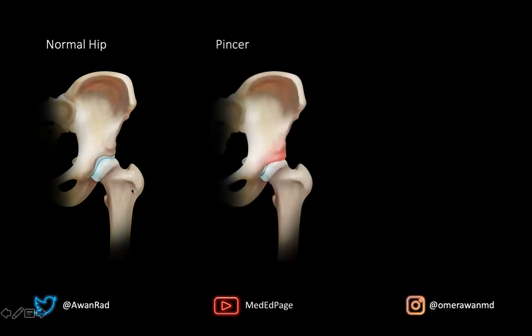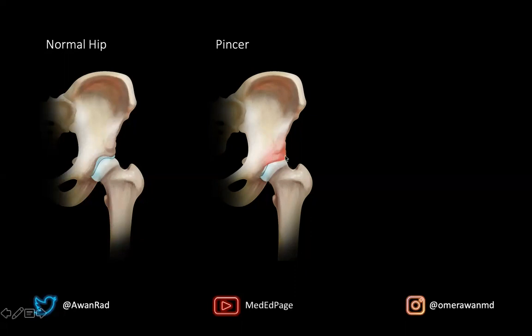In the pincer type of femoral acetabular impingement, too much of the acetabulum covers the femoral head, resulting in impingement on the femoral neck. You'll get labral tears, cartilage issues, and early osteoarthritis — one of the major devastating complications of femoral acetabular impingement. In the pincer type, there is more over coverage of the acetabulum compared to the normal situation.